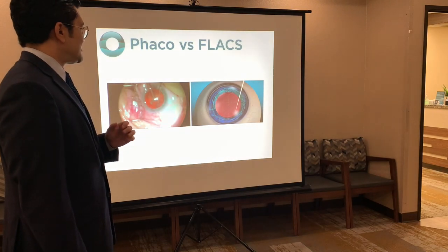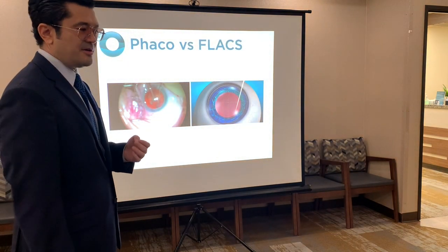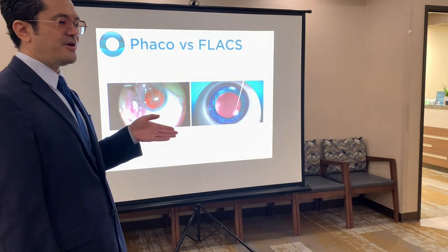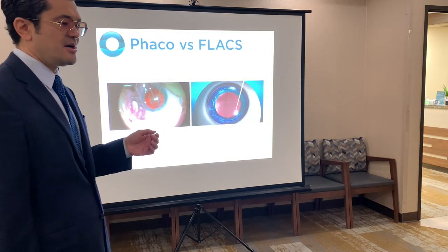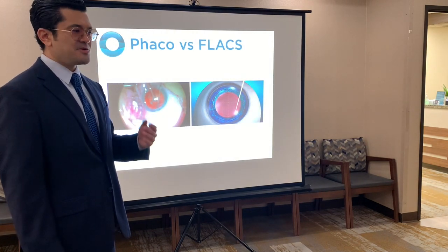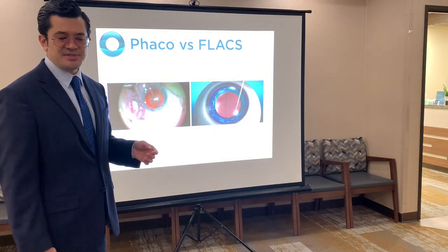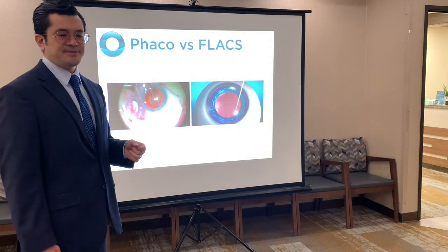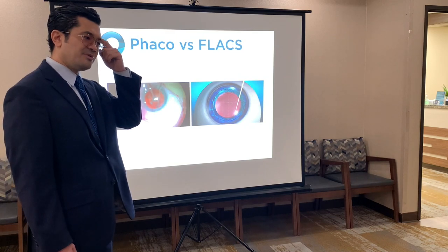So, not really the technique I prefer, because the trouble with divide and conquer is you have to create a very large trench in the center of the cataract, and that does apply a lot of pressure to the zonules, and it uses a lot of ultrasound energy. And so how do we avoid applying too much energy?